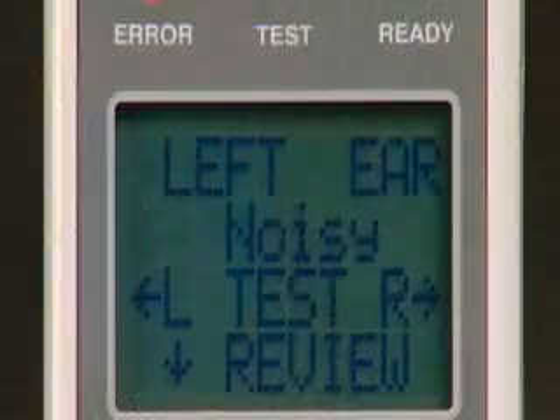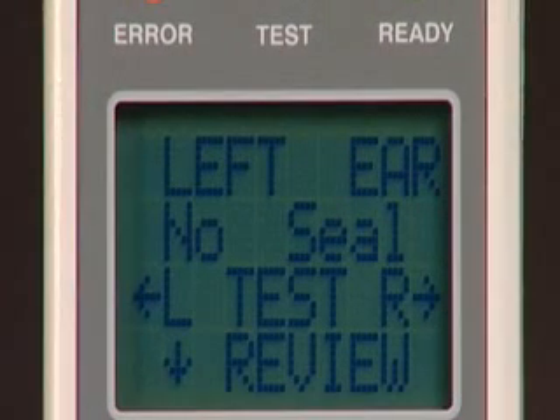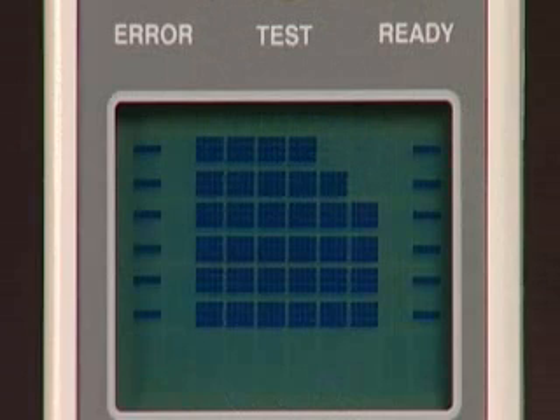Noisy indicates that excessive noise was present during the test, while no seal indicates that a seal was not maintained throughout the test. To review the test results, press the down arrow key and the results screen will appear. The bars represent the signal-to-noise ratio of the emission at each frequency tested.